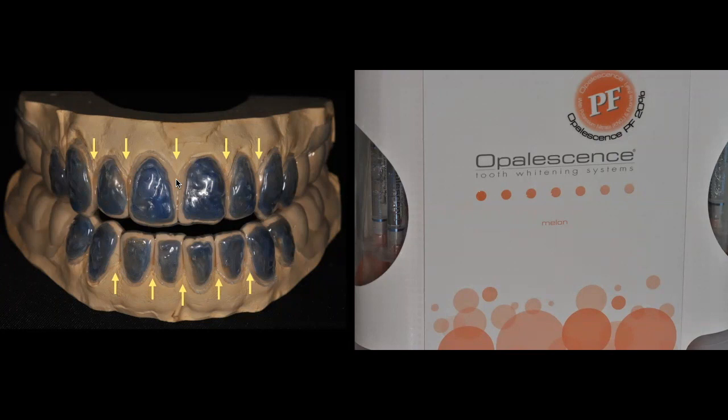The best way to do bleaching, and that's why we call it night guard bleaching, is when the patient is sleeping, just use the tray. They get the full benefit of the product. The tray is going to be in their mouth for approximately 6 hours or more. So you're going to get a lot of delivery of this product through the enamel and having the product interact the way it should to eliminate all the stains within the enamel and the superficial dentin.